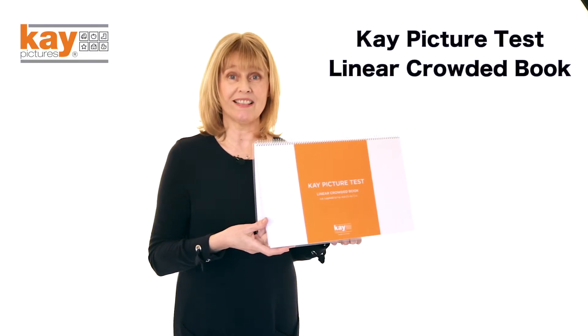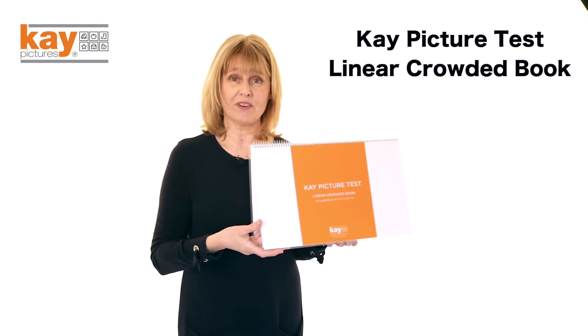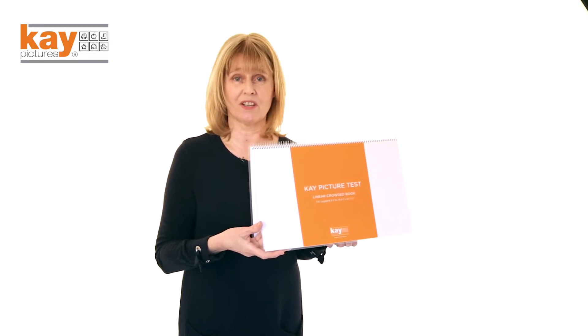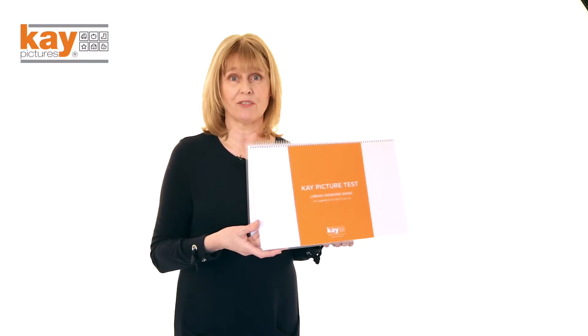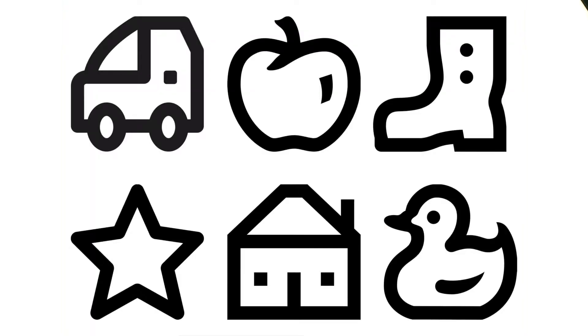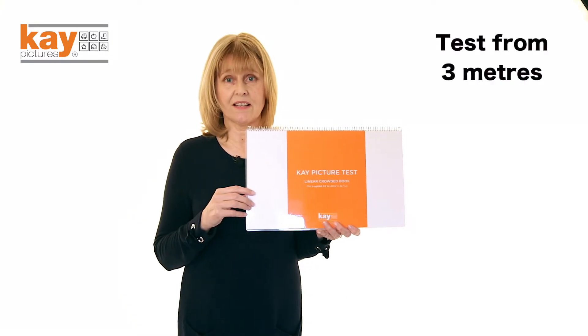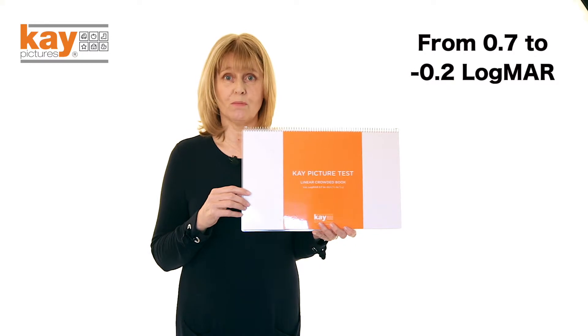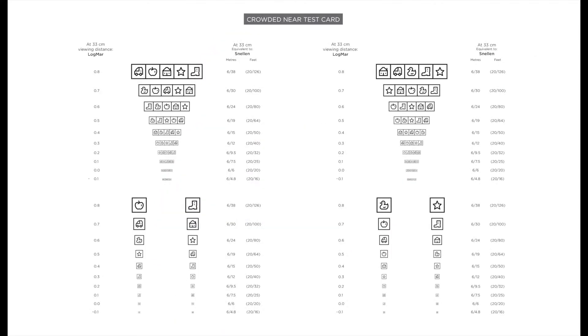This is the K-Picture Test linear crowded book for measuring the visual acuity of pre-literate children from about 36 months of age and for older children and adults with a learning difficulty. It uses these six validated picture optotypes arranged in the book in rows of five. It's a three meter distance test and the sizes go from 0.7 to minus 0.2. There is also a near test card included. All the sizes are displayed in Snellen meters and feet.